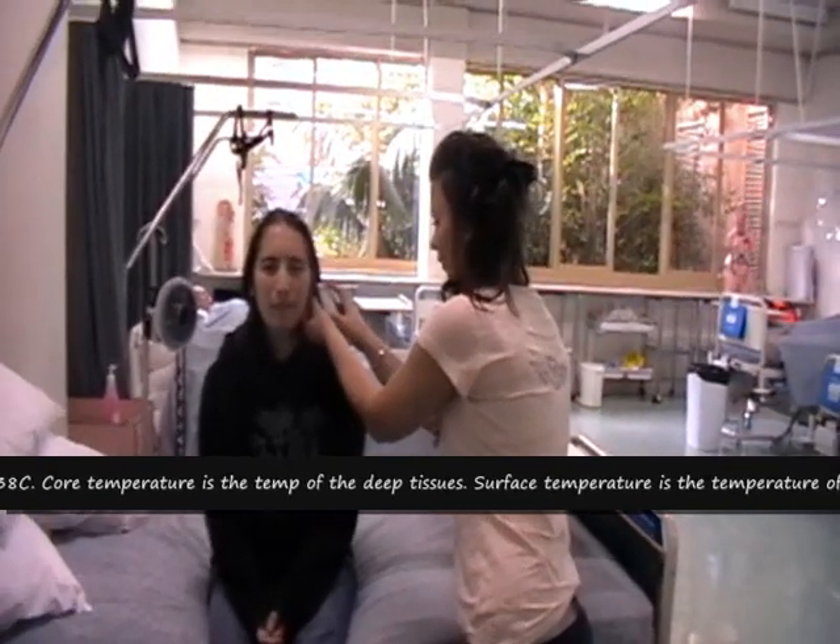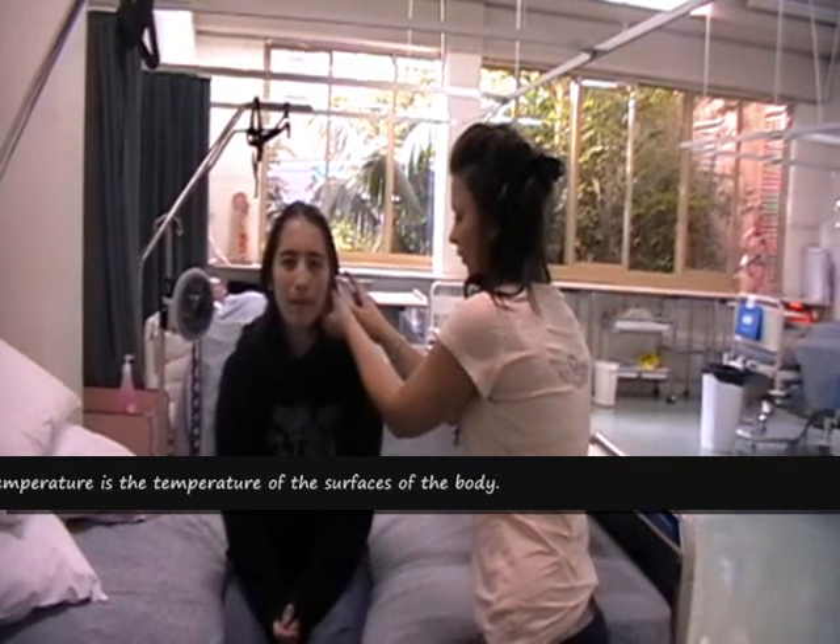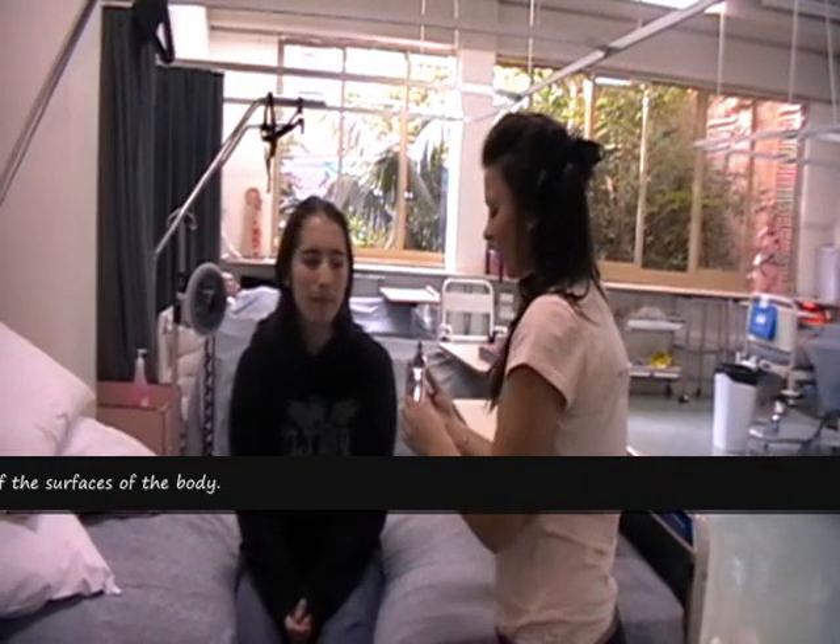Place the thermometer firmly into the patient's ear. Press the trigger on the underside with the index finger and wait for a reading. Chart this recording.